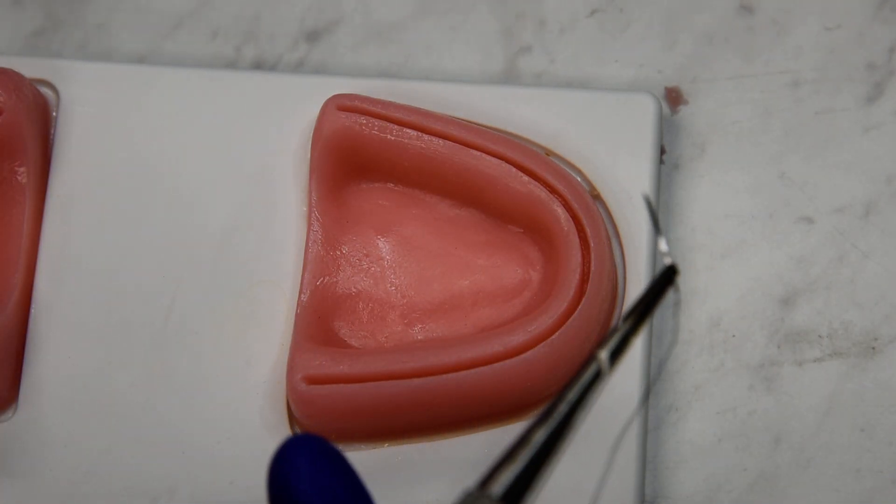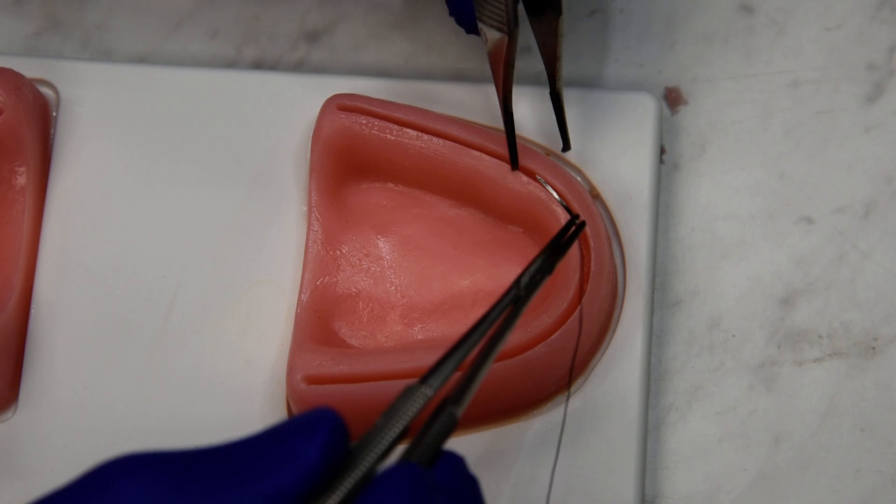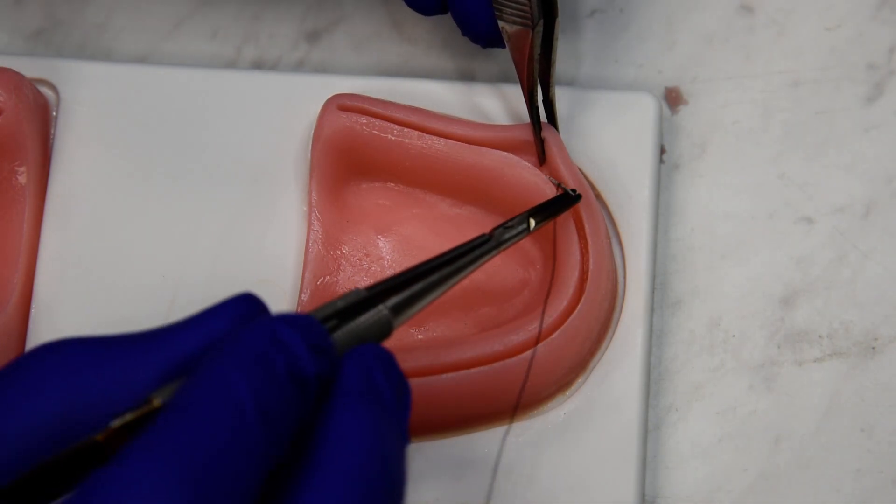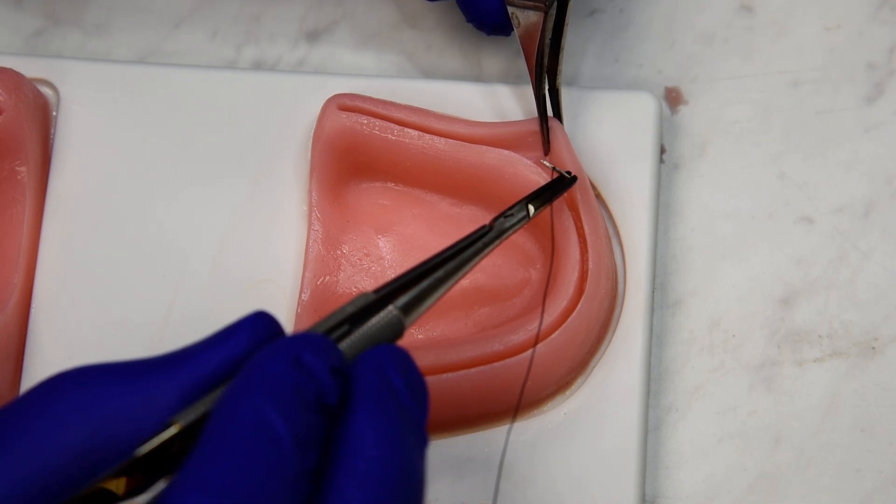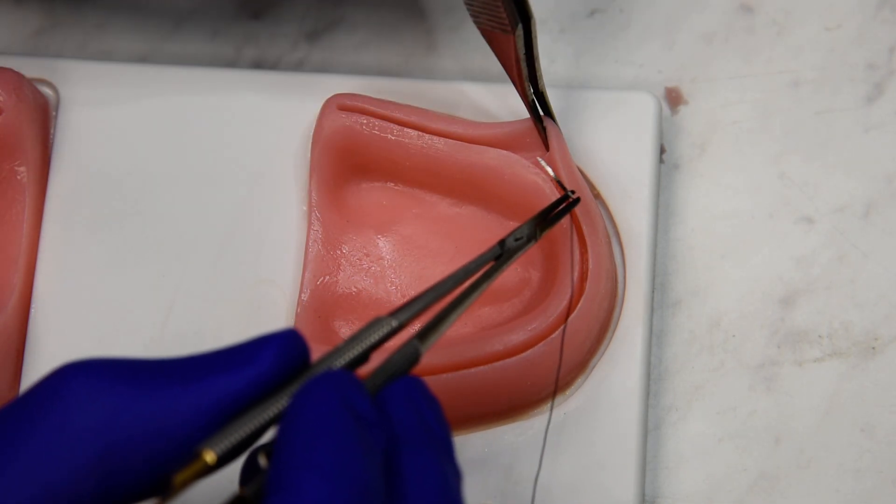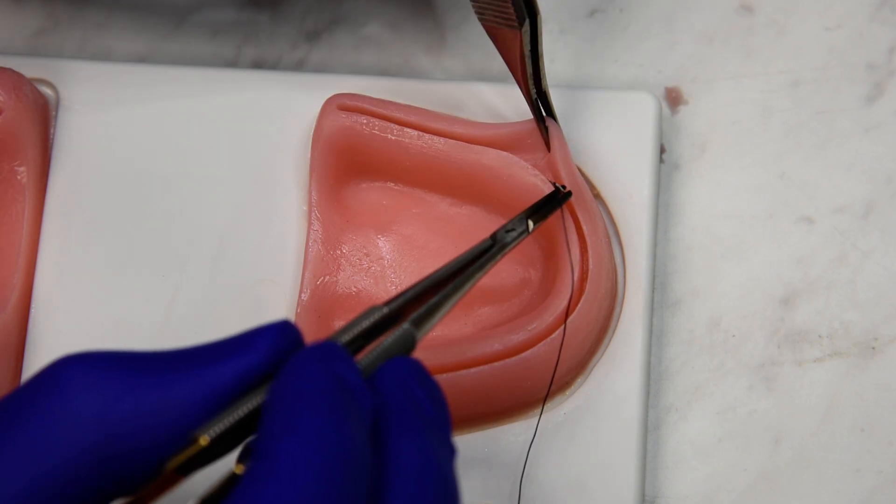For a subperiosteal mattress suture, our first bite is going to be deep to the flap on the buckle, just engaging the periosteum. So we're not coming out the buccal flap, and often we're deeper than the vestibule, unlike this model.